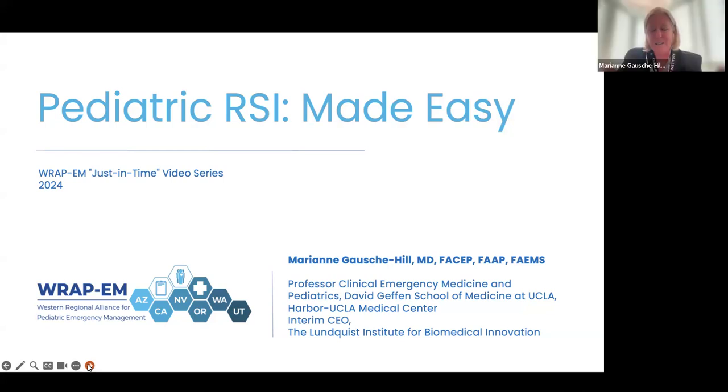Yeah, that's pretty scary. I think probably the first thing I'd like to say is you probably should be prepared before you even get the call. And so there's a couple things to consider. One is to have a length-based resuscitation tape, such as a Broselow tape is one example, because then with that 2-year-old, you can quickly determine weight and various sizes of equipment.